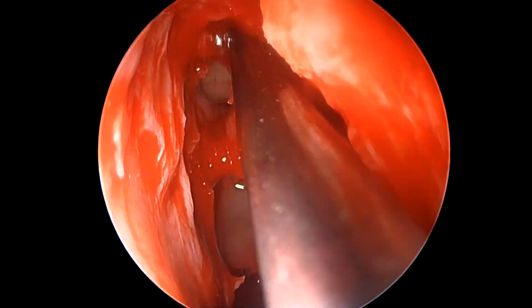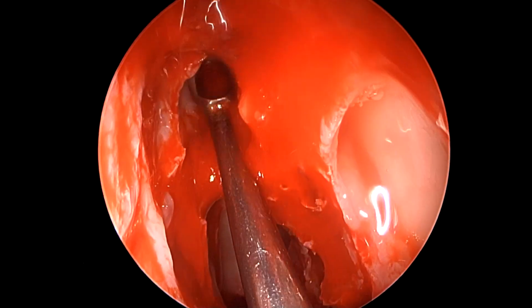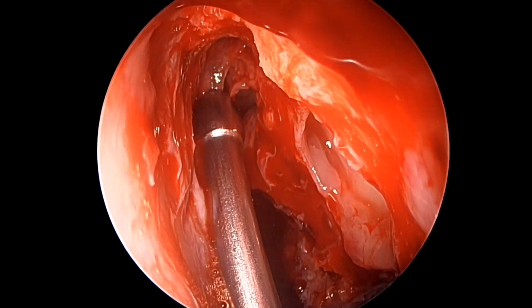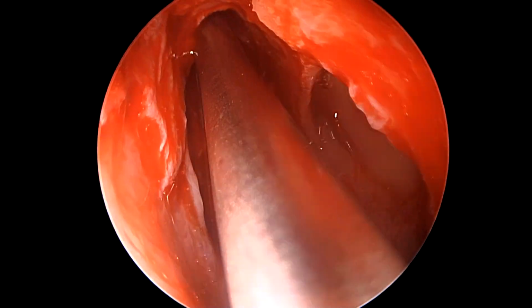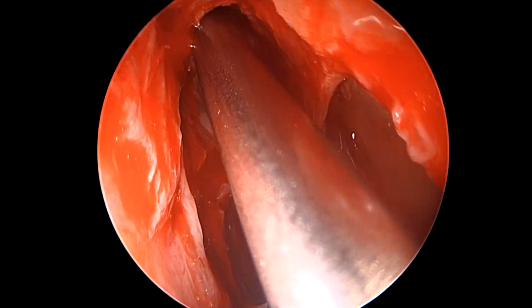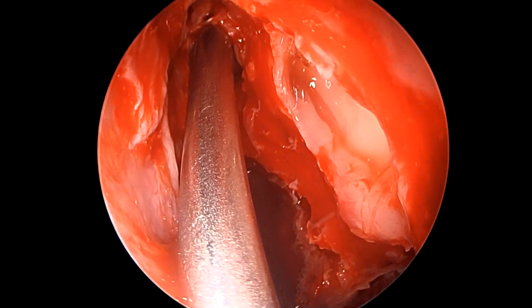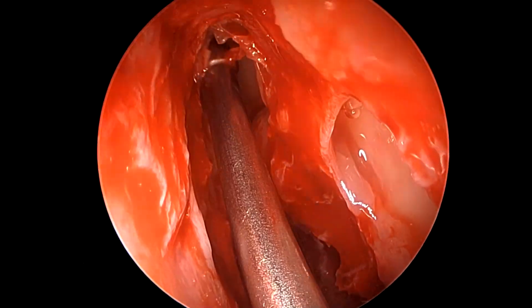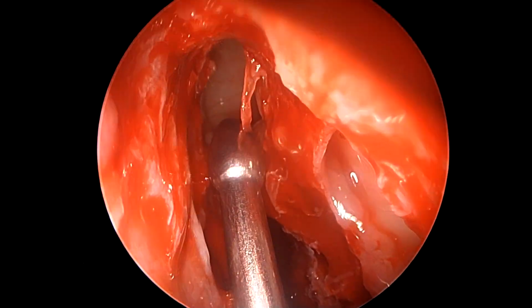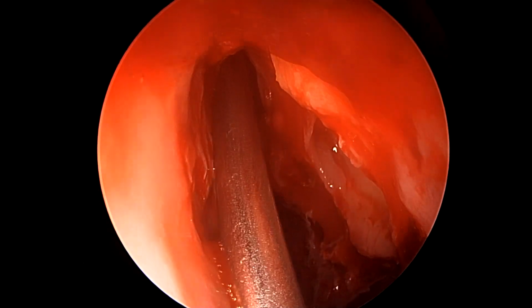Now this cell, as you can clearly see, is anterior to the erstwhile opened frontal bulla cell. So rather than going behind the suprabullar cell, we are now working anterior to the suprabullar cell. And in fact, we can back fracture the lower part of the anterior wall of the suprabullar cell posteriorly, a little bit cautiously, so as to locate the frontal sinus and try to merge these two cells for better communication.